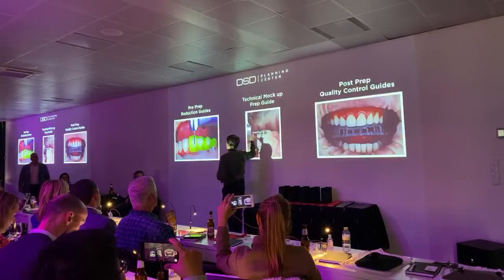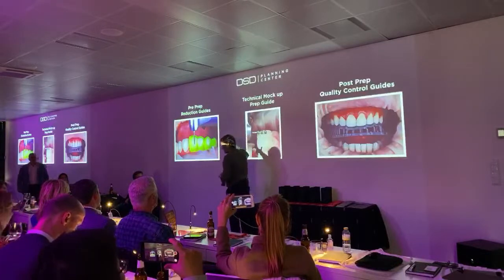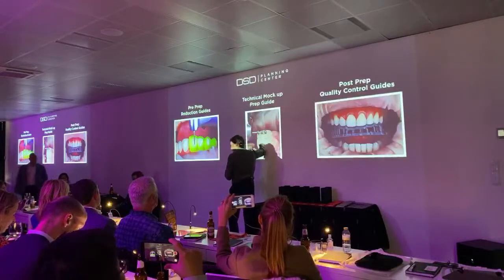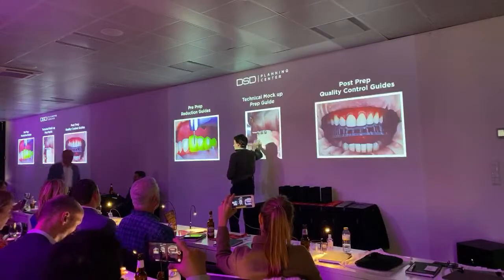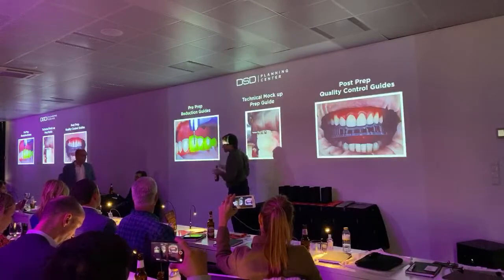So then you fit it into the mouth, make the 3 grooves, remove the mock-up to make it easier. Draw the grooves with a pen, pencil in the grooves to see, remove everything, smooth out the grooves, and you have the buccal and incisal reduction under control. So that problem is probably solved.